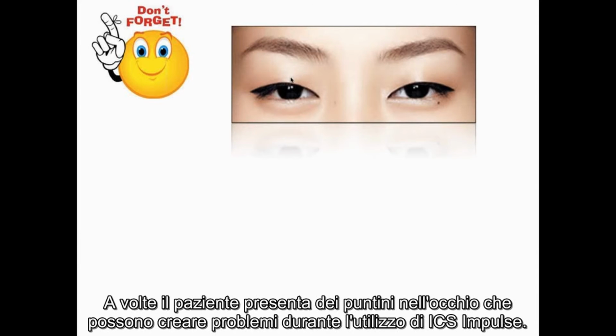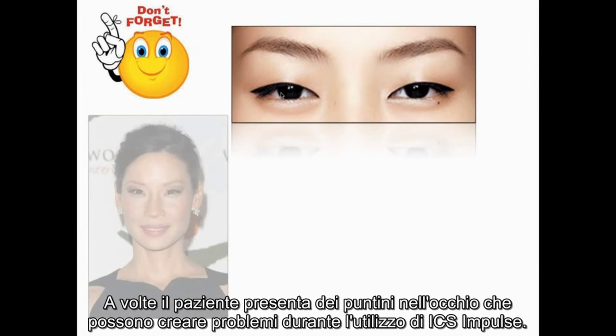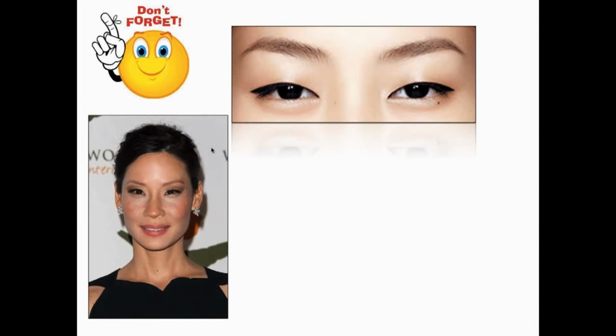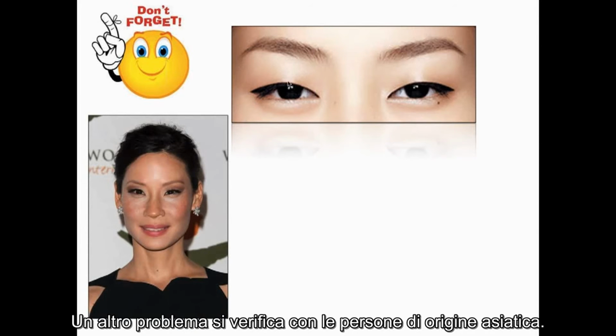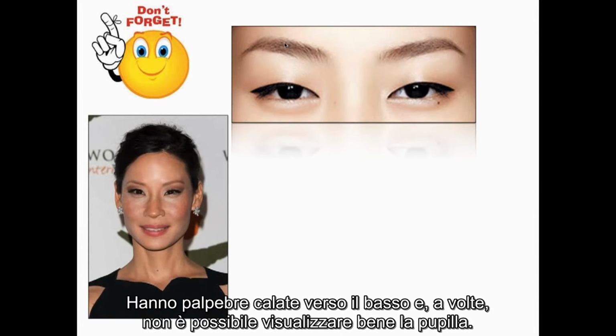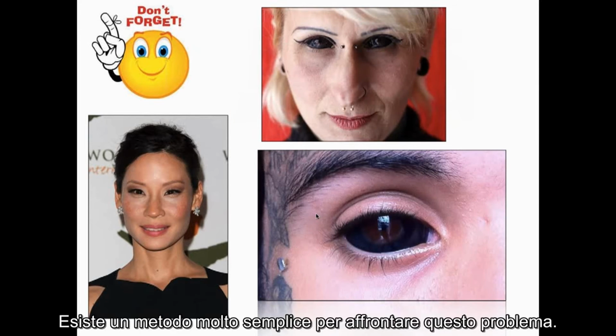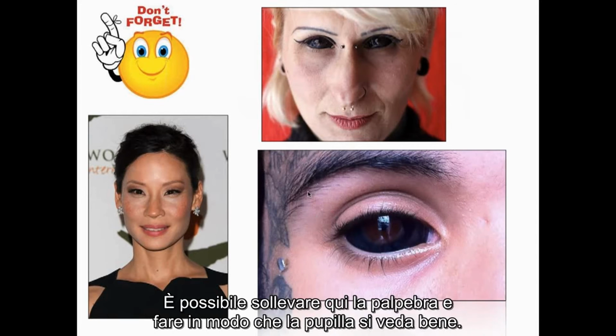And sometimes the patient has little dots in the eye, which maybe can give us some problems during the impulse. Another trouble sometimes is with Asian people, who have drooping eyelids, and sometimes you don't get a very nice pupil, but there is a very easy way to deal with that. You can tape the eyelid and make sure that the pupil is pretty nice.